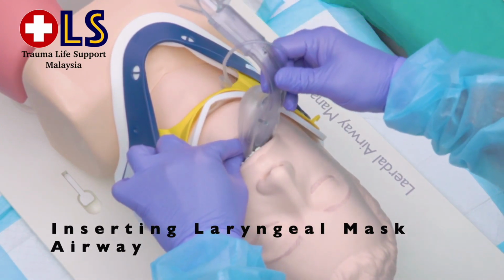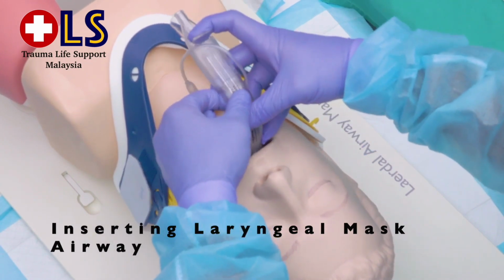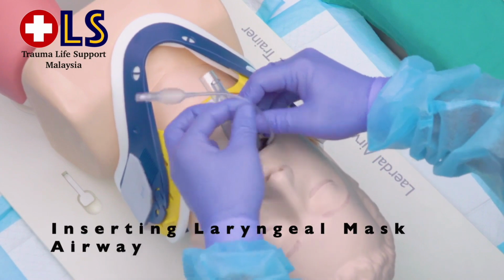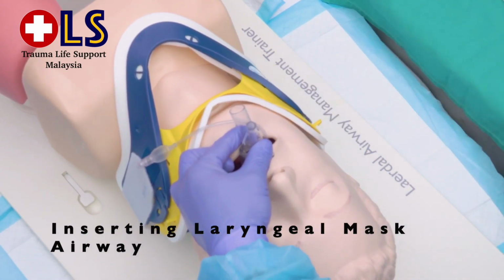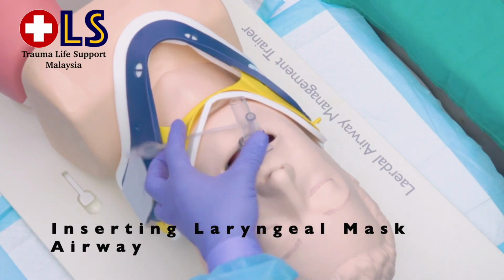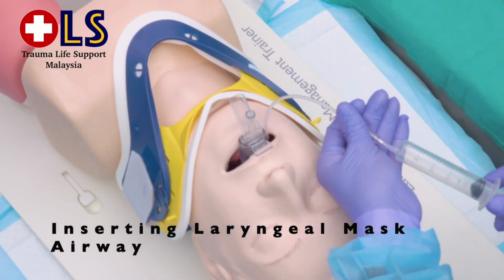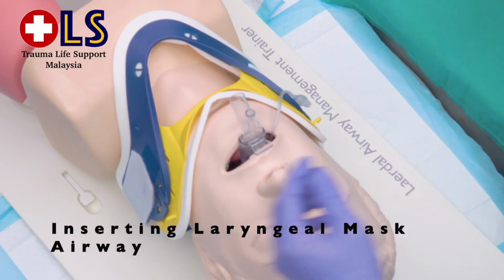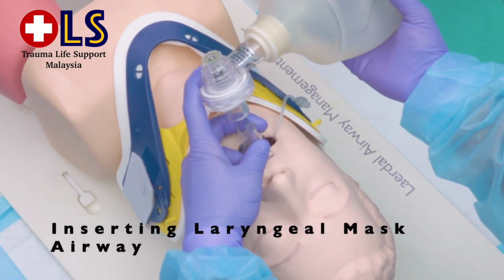Open your airway, gently insert your LMA. Push it in until the maximum that it can go. Further inflate your cuff. Proceed with your bag.